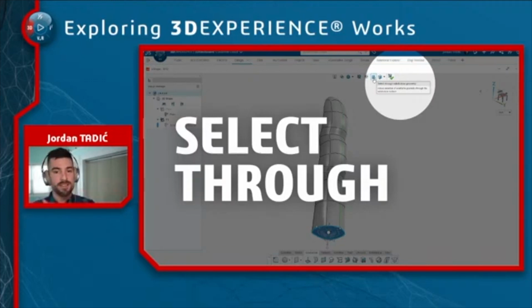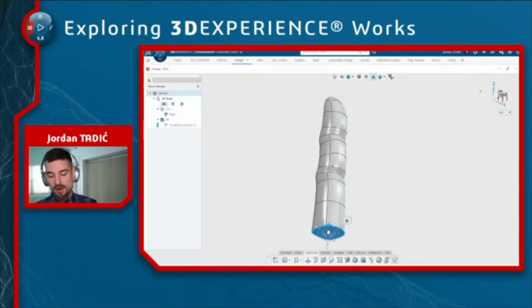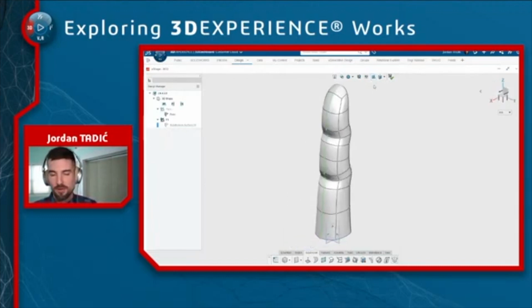The align by line, for one, is a way to ensure perfect tangency or curvature continuity across a mirror plane and no inflection points across a draft or parting line. You could do all kinds of things like that, but I'll show you a few more. In this case, I want the bottom surface to be perfectly aligned to the top plane. That's where it needs to be, exactly there. I can first enable the selection of that plane, and then select that plane as well as the surfaces. From that context toolbar, I can align to geometry. What this is going to do is exactly what I said: it makes a perfect alignment to that top plane. So that is how we can ensure that faces are perfectly aligned.